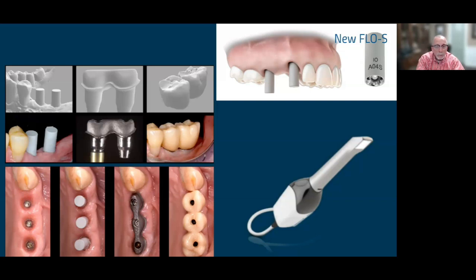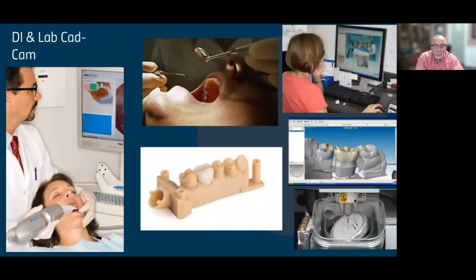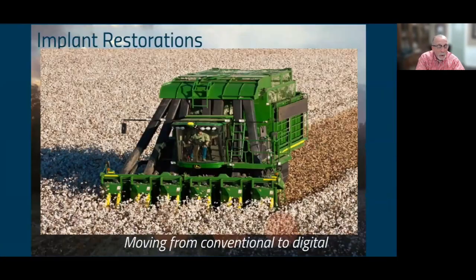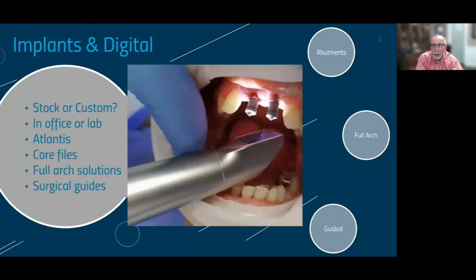So it's super accurate. Then the digital file of that can be sent back to the lab so they can create the zirconia top in the digital workflow. And by the time they finish that, the framework comes in the FedEx box, and they glue the two parts together, and you've got a screw retained 3-unit bridge, and all you did was take a scan. There's no secondary appointment to verify that impression. These things can be done without a model if we want to. It's so accurate. That's kind of how far we've become as far as digital scanning for implants.